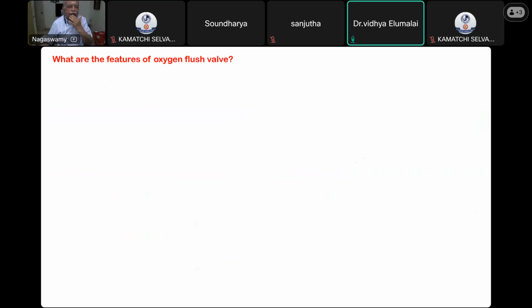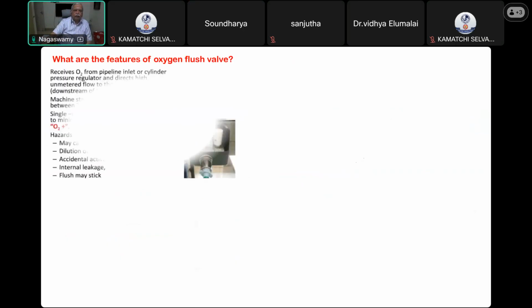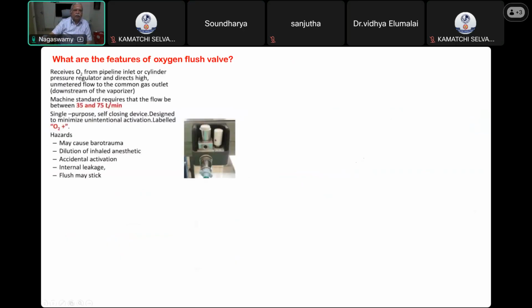So how much oxygen will be delivered when you activate that? 35 to 75 liters per minute. At what pressure? At the pipeline pressure.